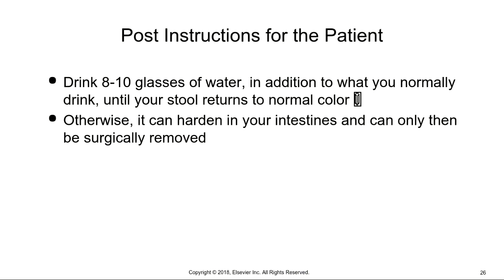As with any kind of barium or even the water-soluble contrast, if the patient has ingested or we've placed any of that, then the post instructions will remain that the patient needs to drink 8 to 10 glasses of water in addition to what they normally drink until their stool returns to a normal color. Otherwise it'll harden in the patient's intestines, and the only way it can be removed is to be surgically removed. Okay, you don't want to scare the patient, you just want them to understand that there's a reason why you're telling them to drink as much as you are, and that is only for their own benefit.